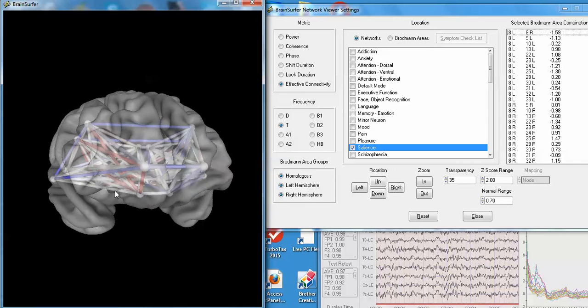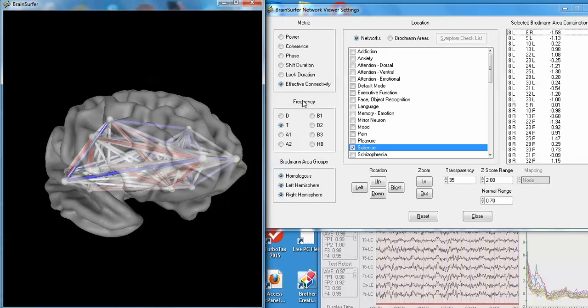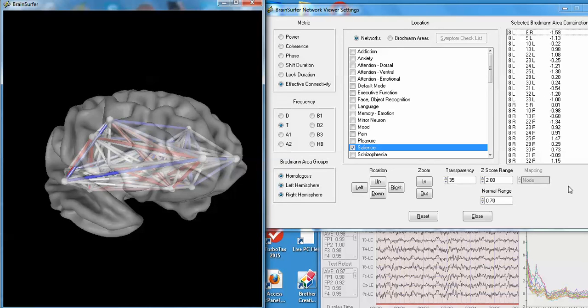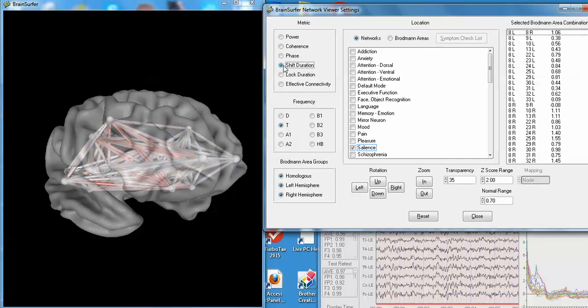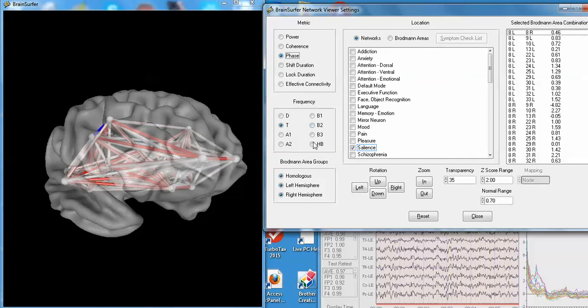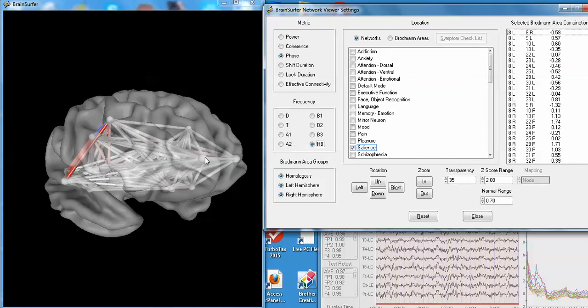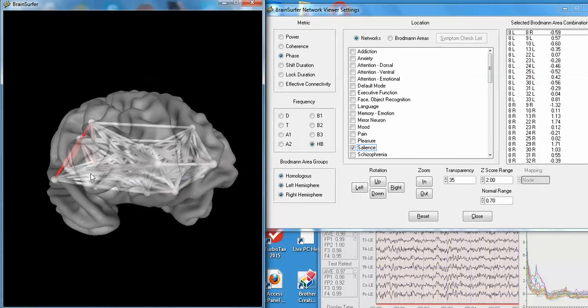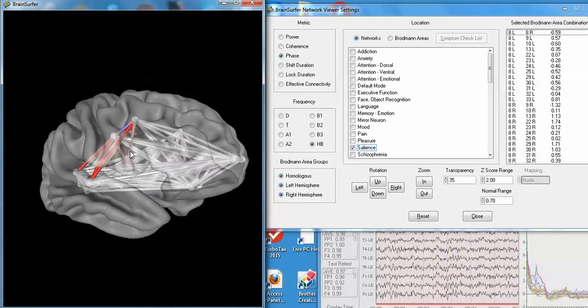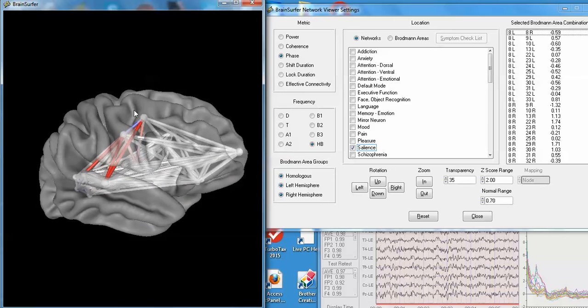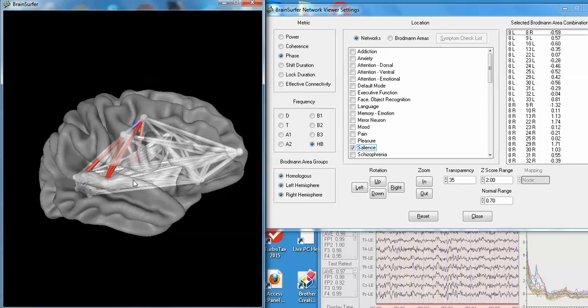One can bring in a symptom checklist, look at different Brodman areas, look at individual Brodman areas, for example. And then, of course, look at each of these features and metrics at different frequencies. There's high beta, for example, for phase differences. Again, the right hemisphere is deviant from normal. So it's deviant from normal in a variety of different metrics, particularly involved with the right parietal lobe and the right occipital and, to some extent, the right frontal lobe.